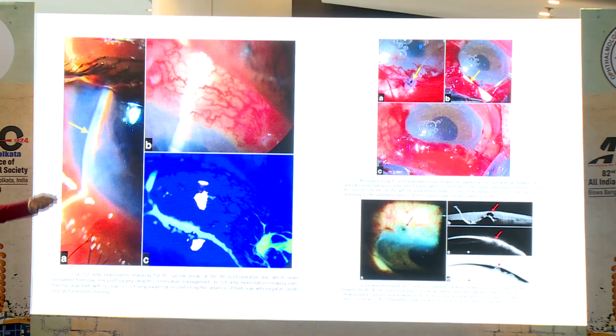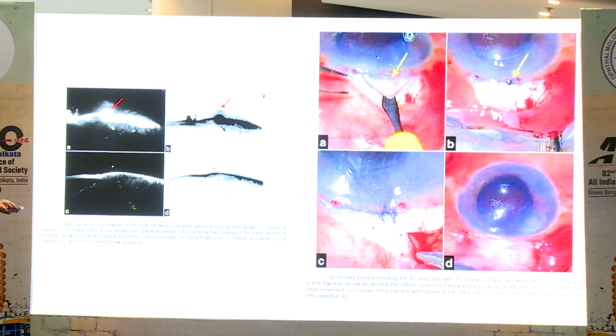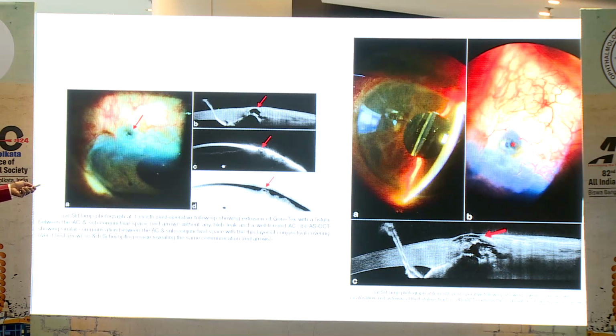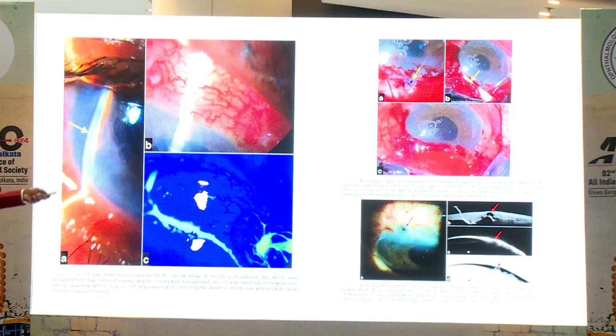But when we studied and evaluated, you can see that there was thinning happening, and there was a fistula here. Meaning that when there was an iatrogenic entry, we tried to use Gore-Tex to arrest the fistula, but it was not working. Because we were not able to get scleral patches or corneas, this is in the first lockdown that I am speaking of. So we did have Gore-Tex, and we were able to at least see where we are.